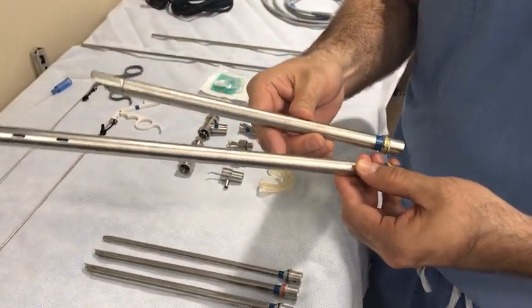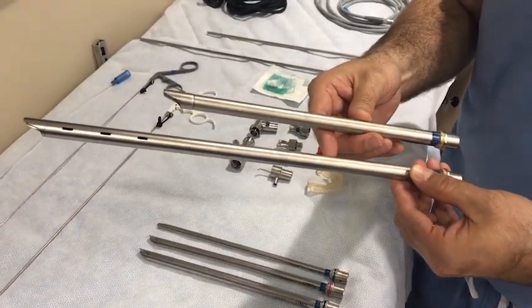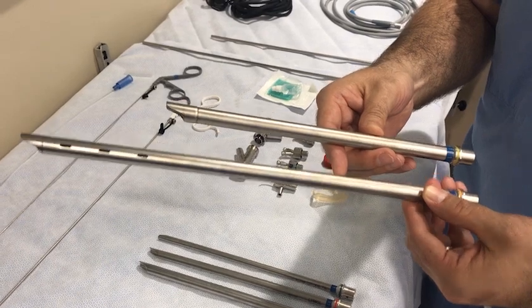The blue scope has an internal to external diameter of 6.5 to 7 millimeters. The rigid tracheoscope is also similarly color-coded. You can see the length difference between the tracheoscope and the Bronchoscope and the presence of side ventilating ports on the Bronchoscope.